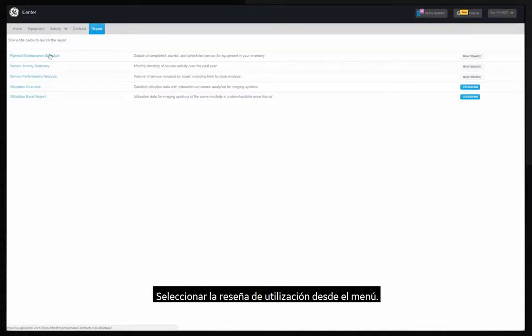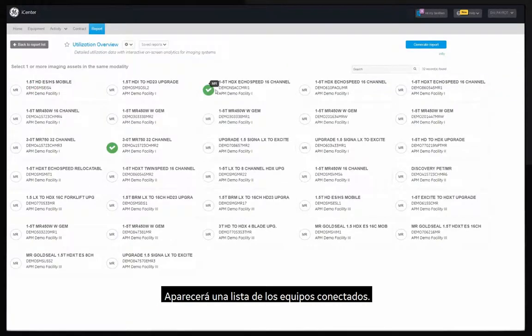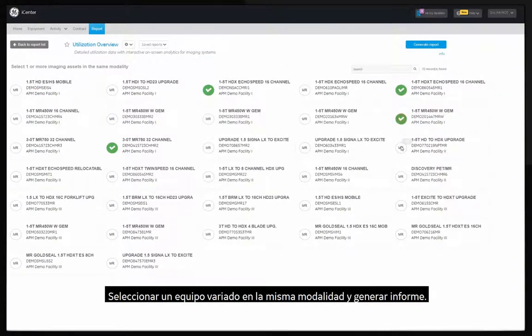You can launch utilization reports from iCenter homepage by clicking on the tile or the report tab. From the menu select the utilization overview. The list of connected equipment will appear.